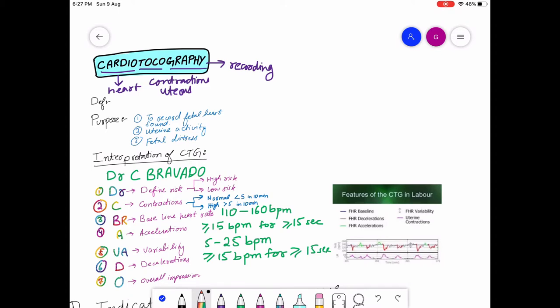As you can see, I have marked three things: cardio means heart, toco means contractions of the uterus, and graphy is the recording. So it is the recording of the fetal heart and contractions of the uterus. It is usually done during the third trimester, which is about 27 weeks till the end of pregnancy.